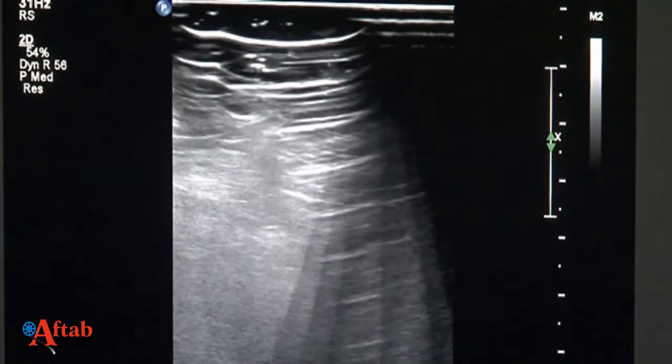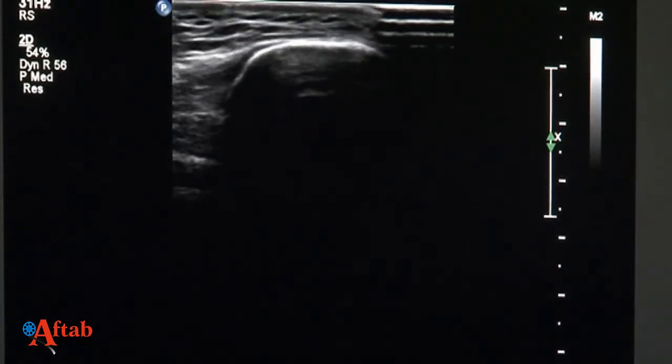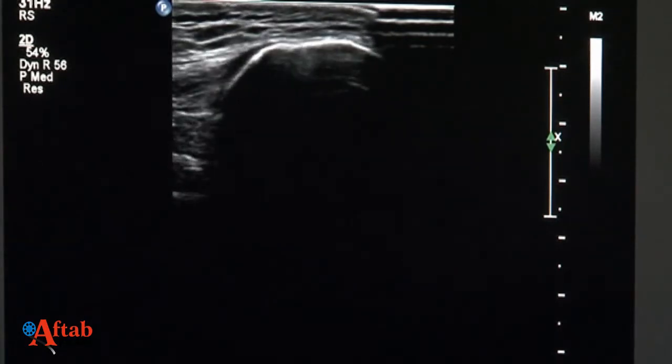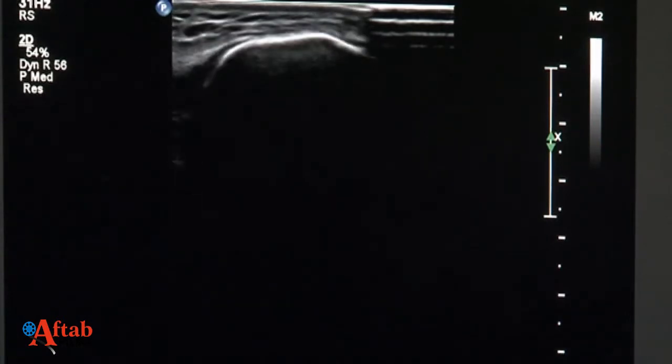From here, I'm going to go on to the pathology with which this gentleman is presenting. As you can appreciate clinically, there is a lot of swelling of the knee joint, and it looks as if there are inflamed soft tissues, or maybe the joint, as compared to the superficial. This is the normal prepatellar region I'm showing. So that's the patella, and the prepatellar region that you can appreciate here.